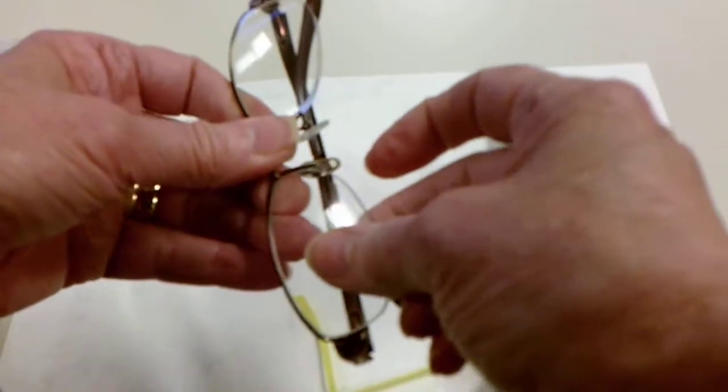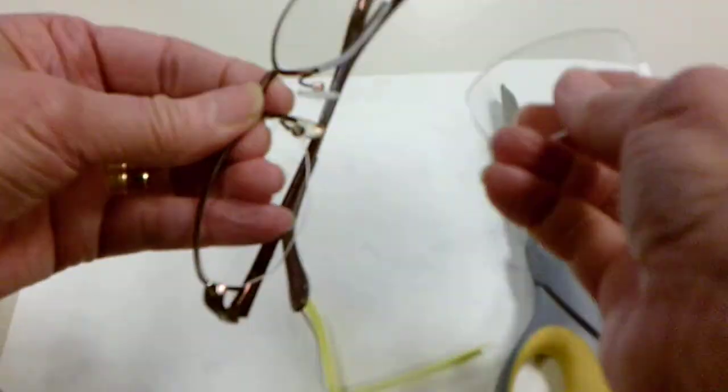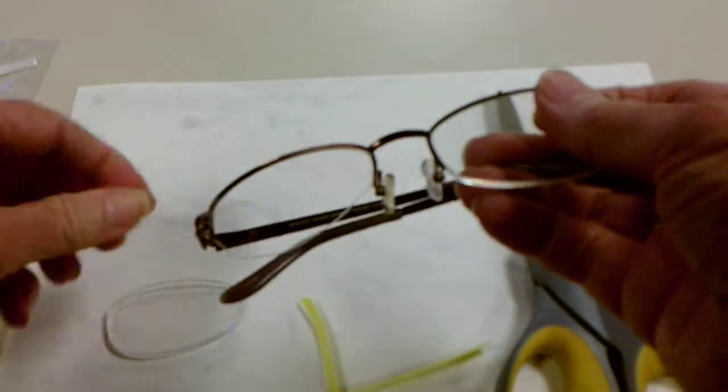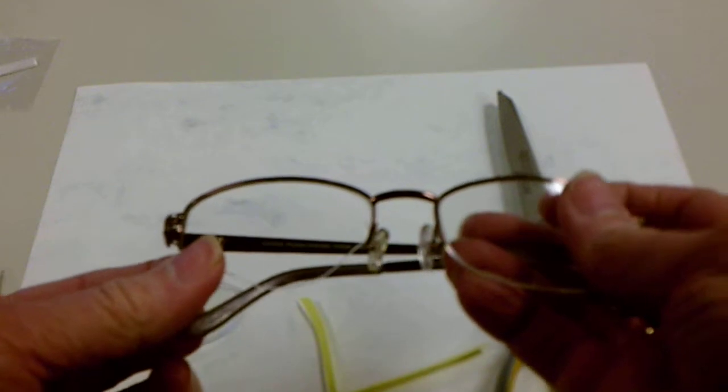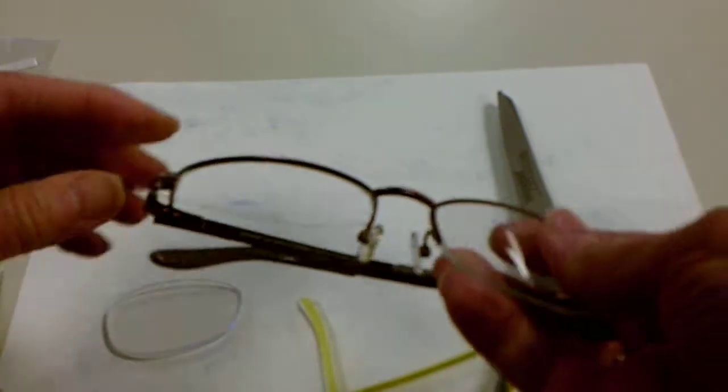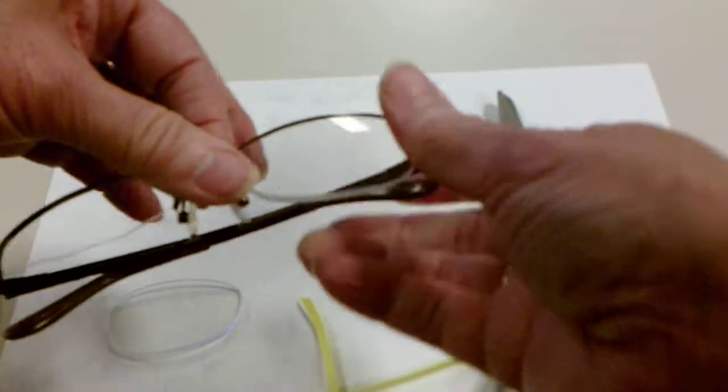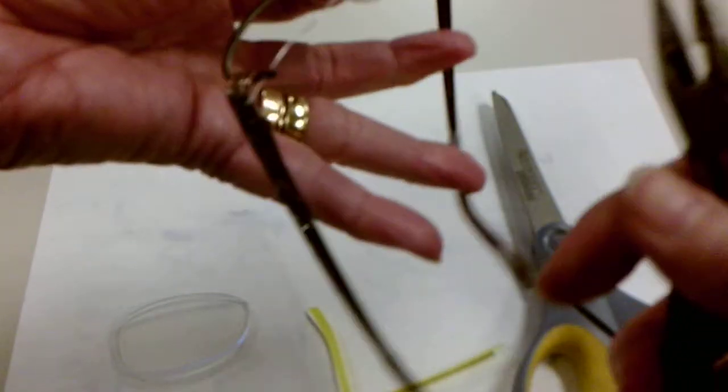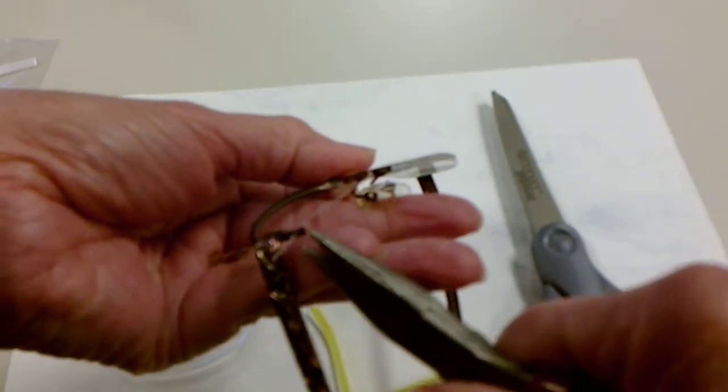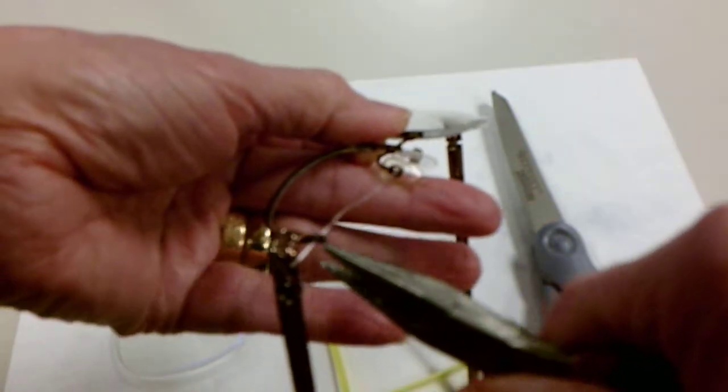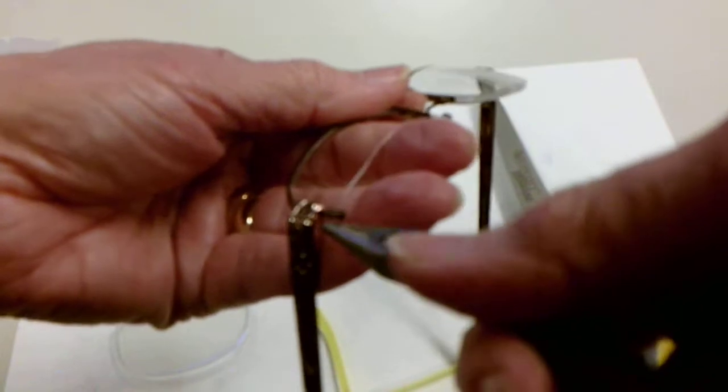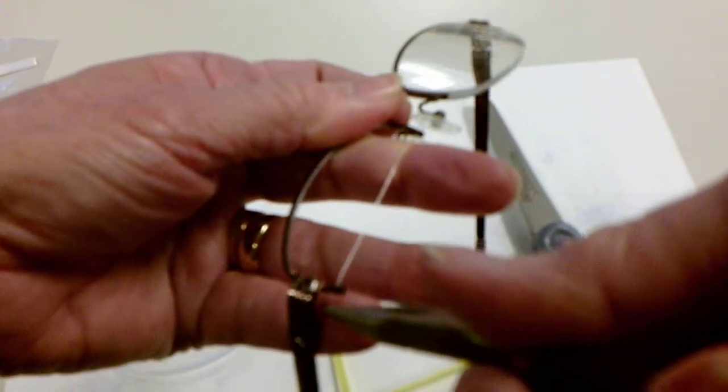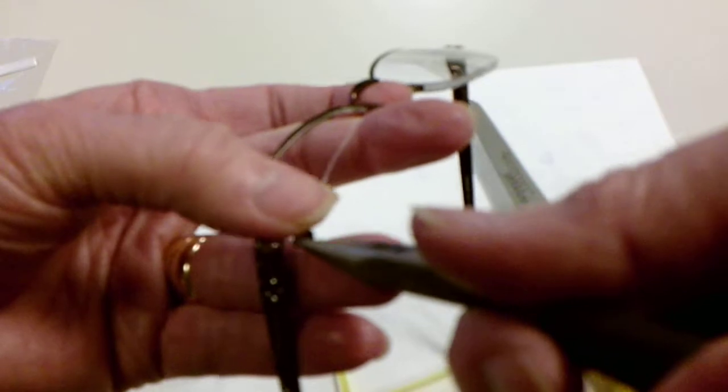Now we're going to remove the lens and thread this outer section back in through the upper hole. Here's where I like to use my needle nose to thread it back in. So here's our little piece. We're going to thread it back in the other hole so it will be able to be held in by tension.